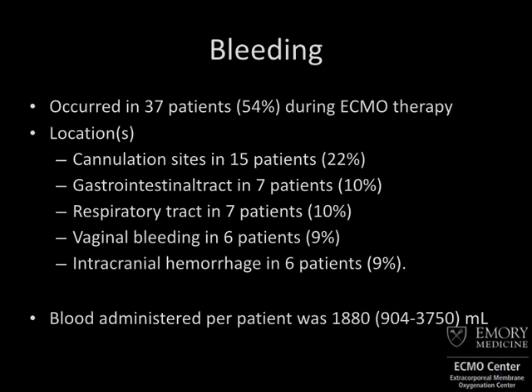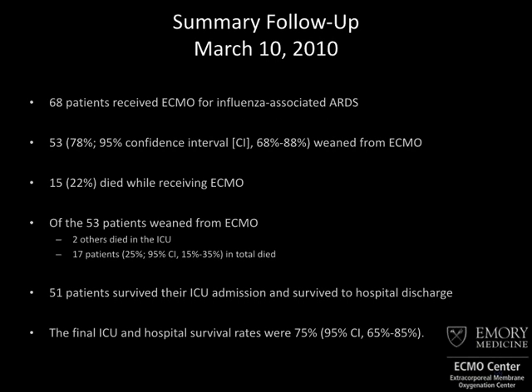When they followed up a year later, it was essentially 75% survival for those that got cannulated for ECMO, which is a far difference from the 90% mortality from the data from 1979. And I think that's the key thing to keep in mind here, is that this has been proven to be a much different technology, a much safer technology than we had before.